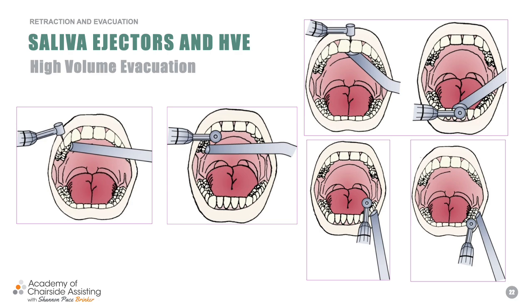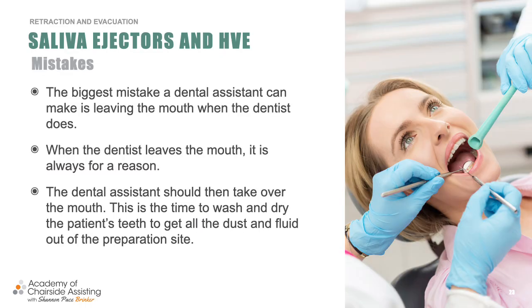So now when we're looking at our doctor working on the mandibular left quadrant, you see where my suction is, right? My goal always as a dental assistant, your role, is to pull that cheek out of the way so the doctor can get the handpiece in and not cut the cheek, not cut the tissues. And our job is to protect that patient's lip, mouth, and tongue from that burr, okay? So just make sure that you familiarize yourself with these areas. And again, it's all repetition, right?